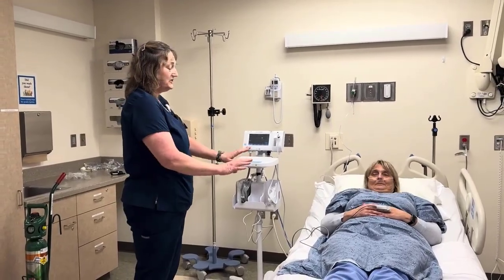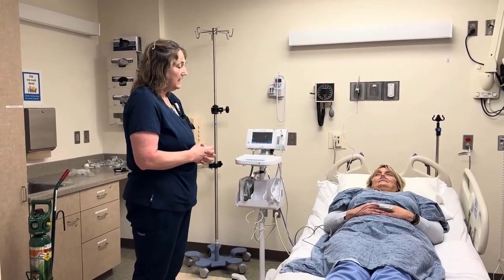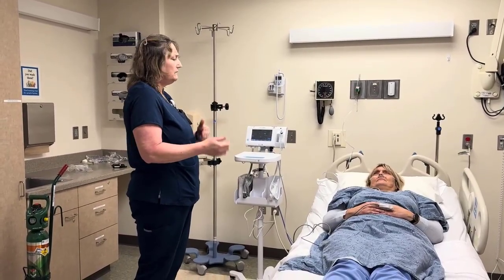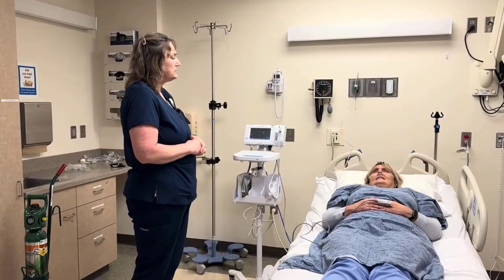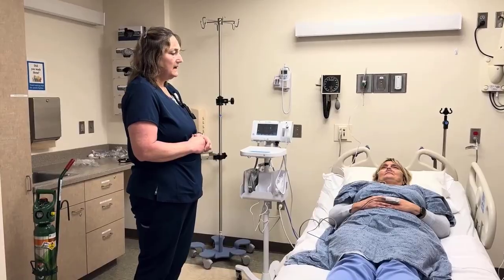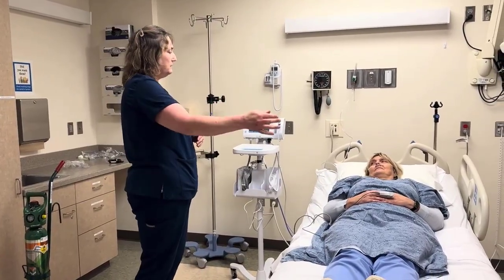And it's not as bad as you think it's going to be. We're just going to take a little walk. How much exercise do you think you do at home? How much walking? How far do you walk? What's your main exercise at home? To the mailbox and back. Okay, to the mailbox and back. And is it at the end of your driveway, would you say?